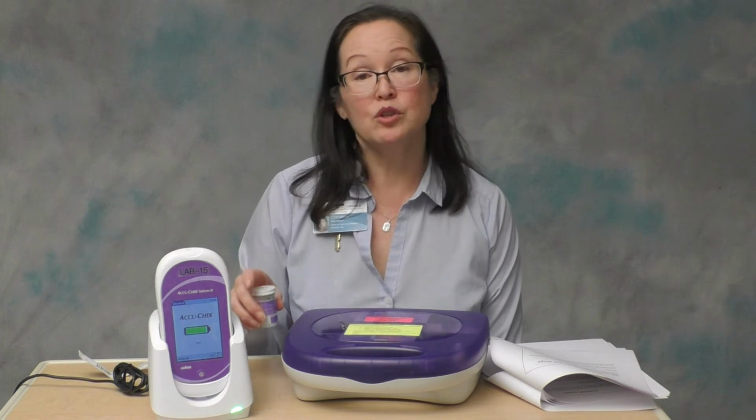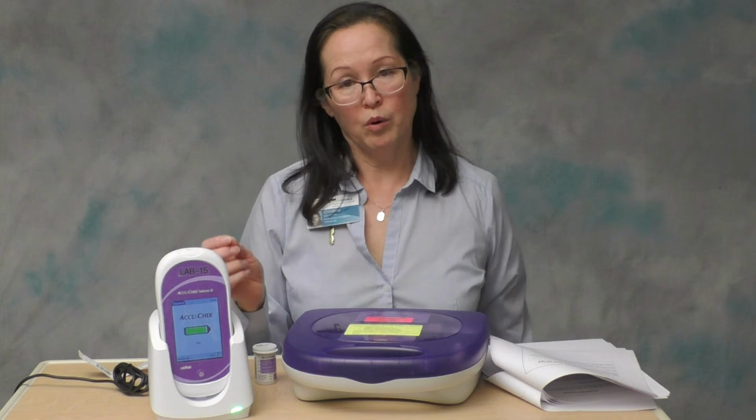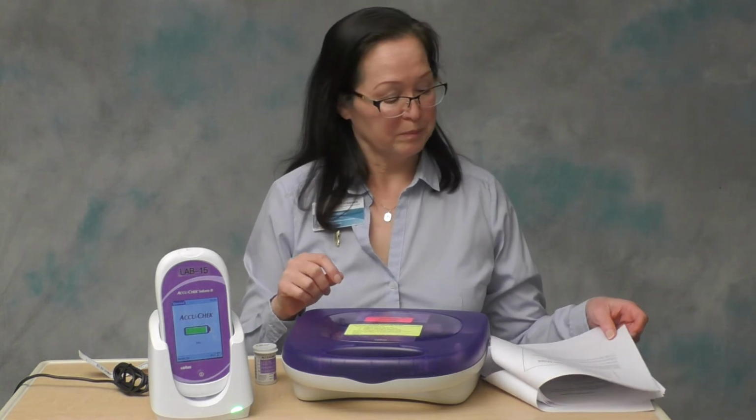This could happen with either QC testing or patient testing if you try to dose it too soon or if you try to insert the strip too soon.